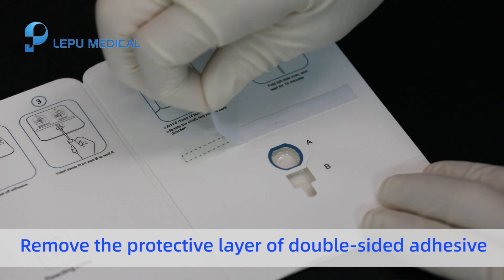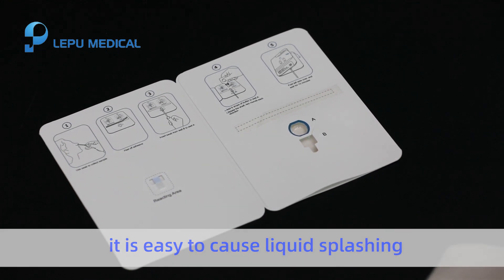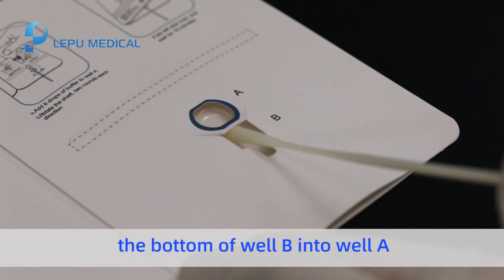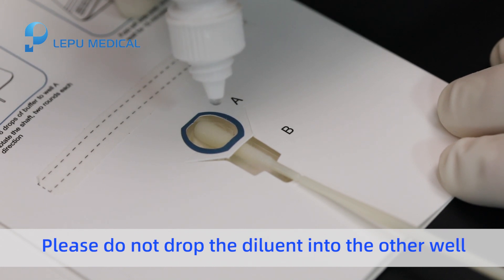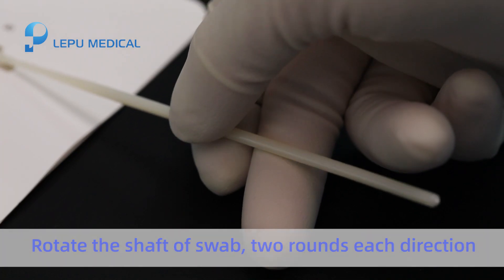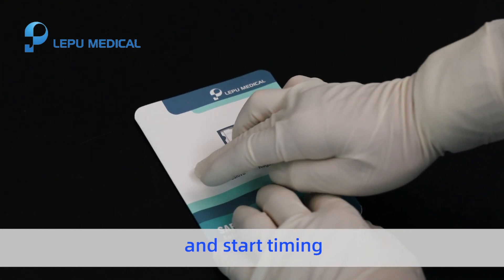Remove the protective layer of the double-sided adhesive. If the protective layer is torn off after adding diluent, it is easy to cause liquid splashing. Insert the sampled swab from the bottom of well B into well A. Add six drops of diluent into well A — do not drop the diluent into the other well. Rotate the swab two rounds in each direction. Then fold the left side over and gently press the adhesive position to make the two sides completely fit, and start timing.